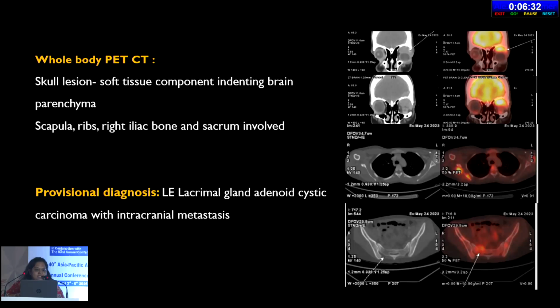Whole body PET CT showed a soft tissue component indenting the brain parenchyma, and other lesions were in the scapula, ribs, right iliac fossa, and sacrum. So the provisional clinical diagnosis was left eye lacrimal gland adenoid cystic carcinoma with intracranial metastasis.